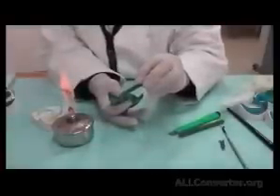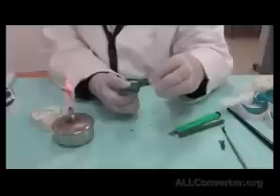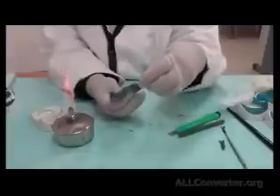So to do that, I'm not only adding the material to the border as I'm doing the first glue step, let's say. I'm adding the first layer on the border itself. But the second layer, I'll be extending the pressure material or the border molding material to the hard palate, the non-mobile part of the soft palate. So I'm adding over the fitting surface of the tray here. Take away excess material.